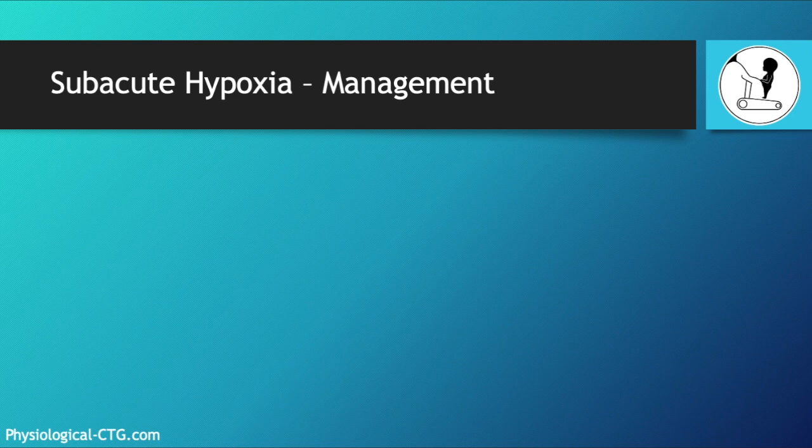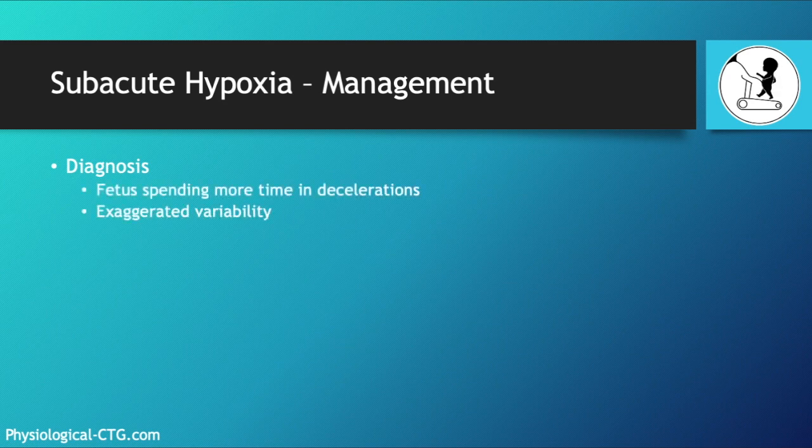How do we manage subacute hypoxia? Once again, management means diagnosis and treatment. In this case, the diagnosis is pretty straightforward. You see a baby that is spending more time in decelerations with episodes of increased exaggerated variability, and you can see that the mother is contracting quite frequently or that she is starting to push.